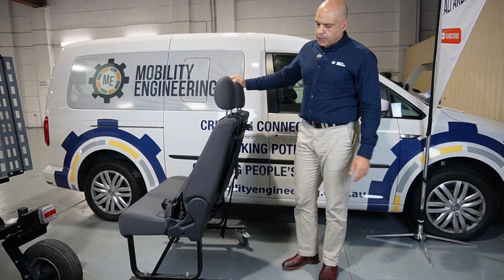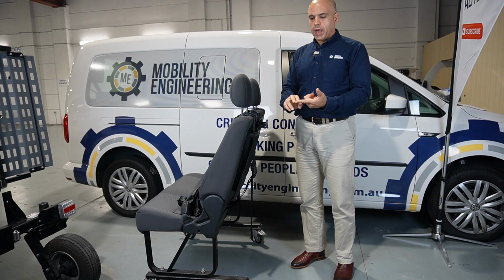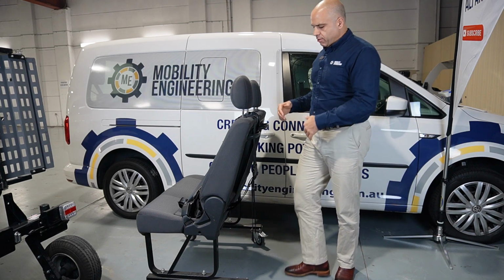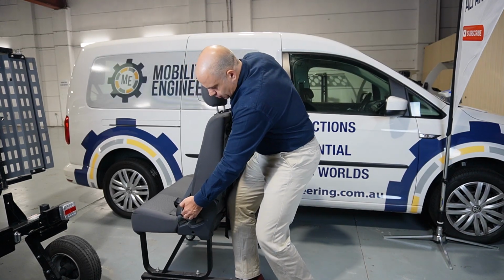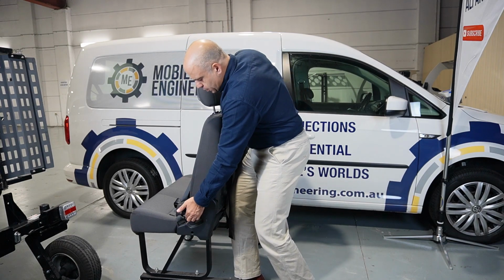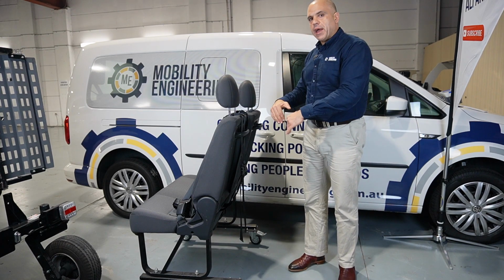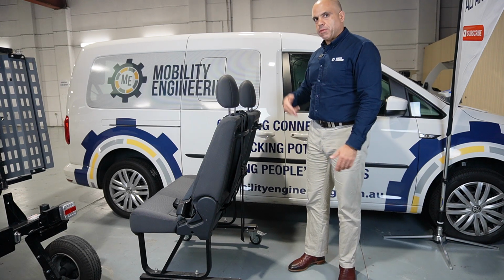If you have a look here, we have a seat that you would typically see in the back of a station wagon, a van, a bus. It is a single standalone seat that has a back, and sometimes the seat can fold backwards and forwards like that. This one is a bus seat, so it's not able to move that much, but some of them, like in station wagons, fold all the way down as well. If you have access to the back of the seat, then you can easily do this, because all you have to be able to do is wrap the straps around.